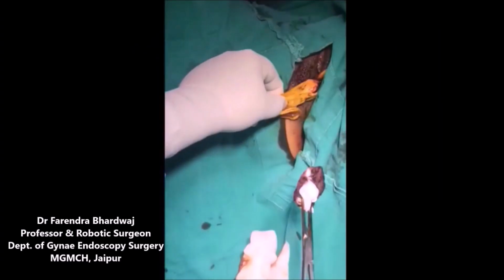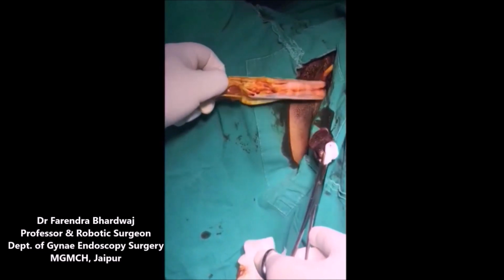Post-operatively, on day 4, the mold was removed. You can appreciate how big the vagina and the margins are looking. And on day 10, you can appreciate how easily a soft mold is going in the vagina.